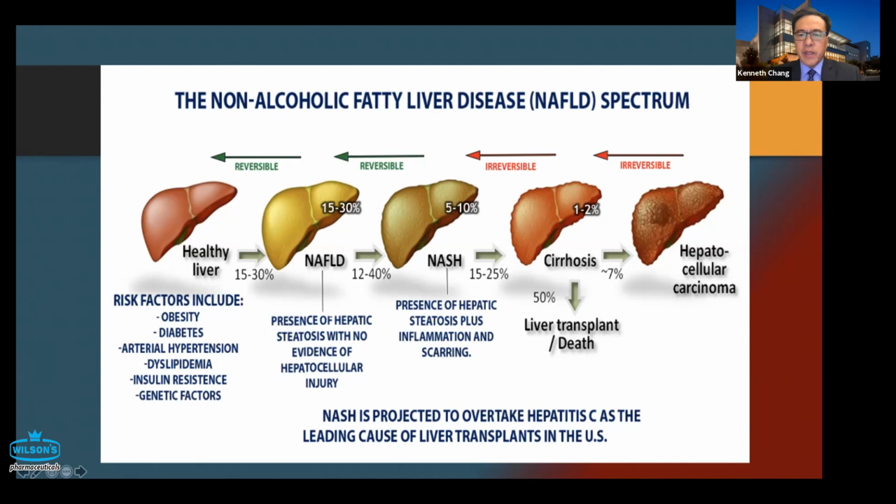The other unmet need would be in patients with NASH or any other liver disease, Hep B, Hep C, and autoimmune hepatitis. We don't always know where they are in their progression towards cirrhosis. So NASH obviously leads to cirrhosis, and if you're going to intervene, you want to intervene before the cirrhosis is irreversible. And so there's another area of unmet need here, and I believe that's where EUS guided portal pressure gradient can really help determining where the patient is in that progression towards irreversible cirrhosis. So two areas of unmet need that I'll circle back to as we continue in this journey.